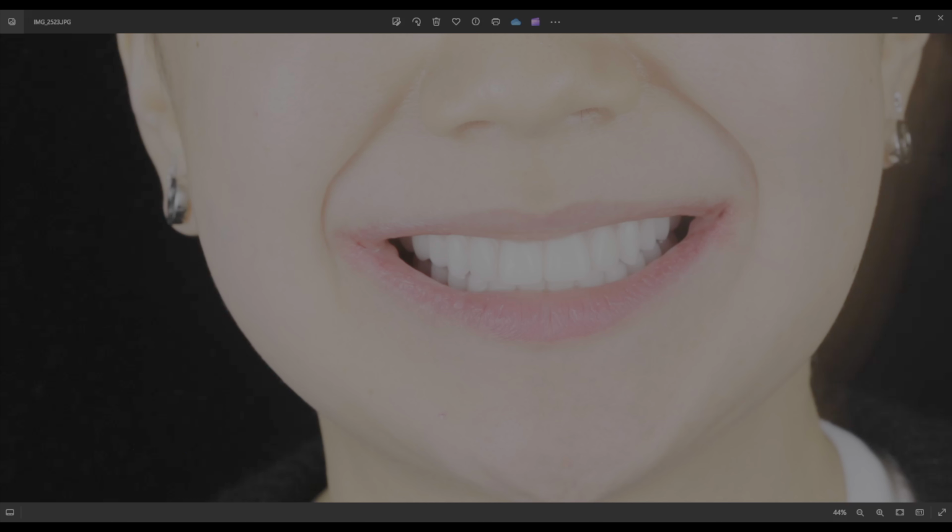All right, thanks. Dr. Koo, what are your thoughts on this case? Yeah, so in this case, Dr. Choi and Dr. Koukousaki were able to successfully hide a transition line, which is the area where the prosthetic teeth and the gum tissue meet. We'll be soon posting our vlogs. We started vlogging, and in one of the videos, we're going to demonstrate how we plan the case to make sure that we do the bone reduction appropriately.